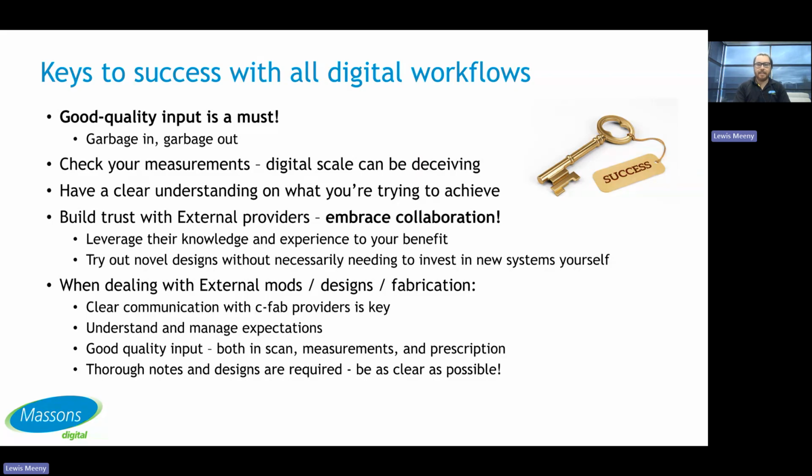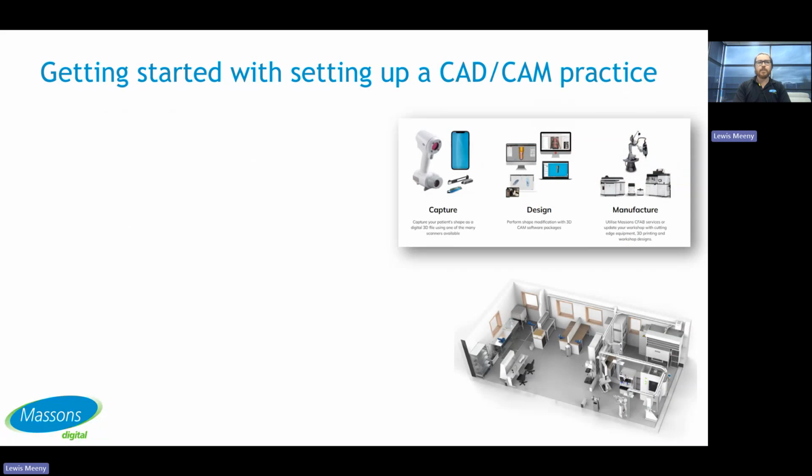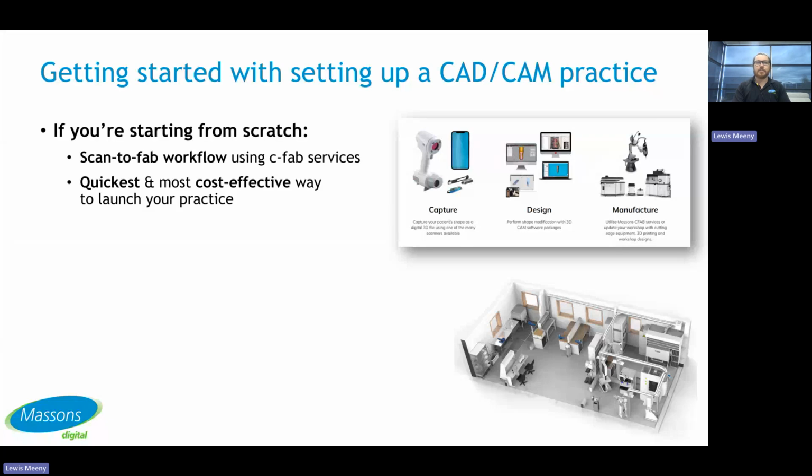It absolutely always helps. So we're talking about getting started with setting up a CAD/CAM practice. If you're starting from scratch, scan to fab workflow using CFAB services is by far the quickest and most cost-effective way to launch your practice. If you're not having to fabricate anything on site yourself, you don't need nowhere near as much workshop equipment.